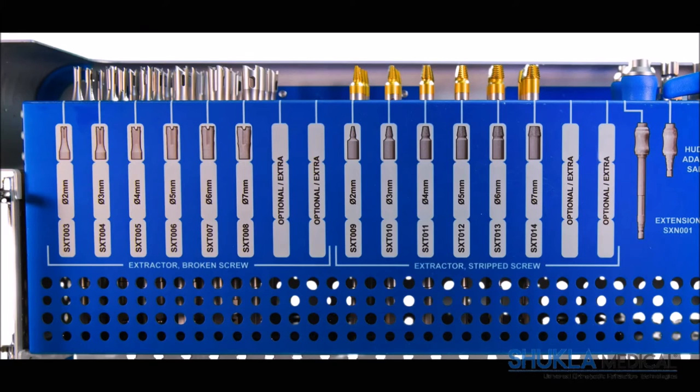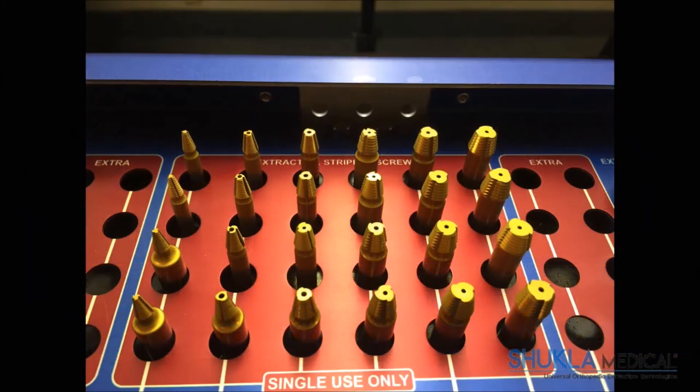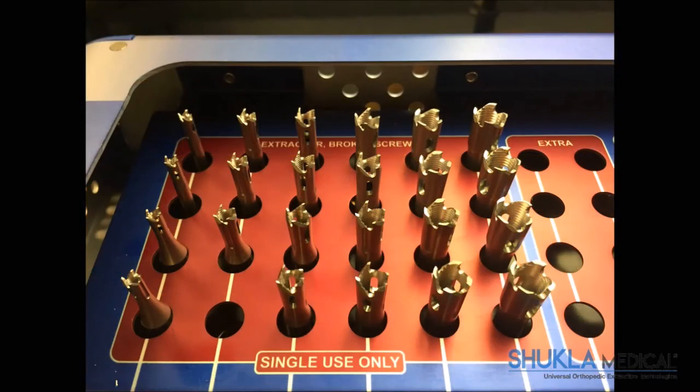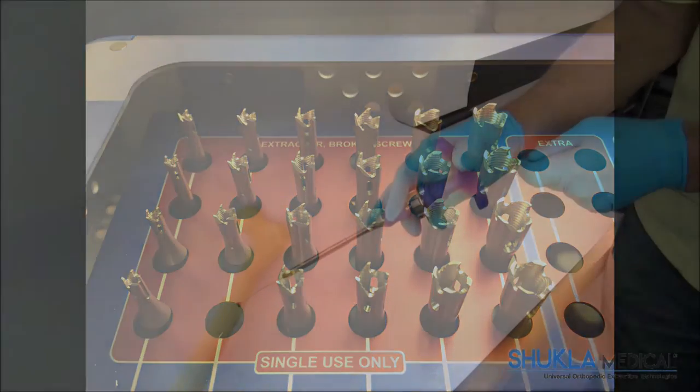The front vertical face of the case shows the name, part number, and location of each of the components in the system. The Extract-All Screw V2 system contains single-use only components. The location of these components are clearly highlighted in red and marked as single-use only.